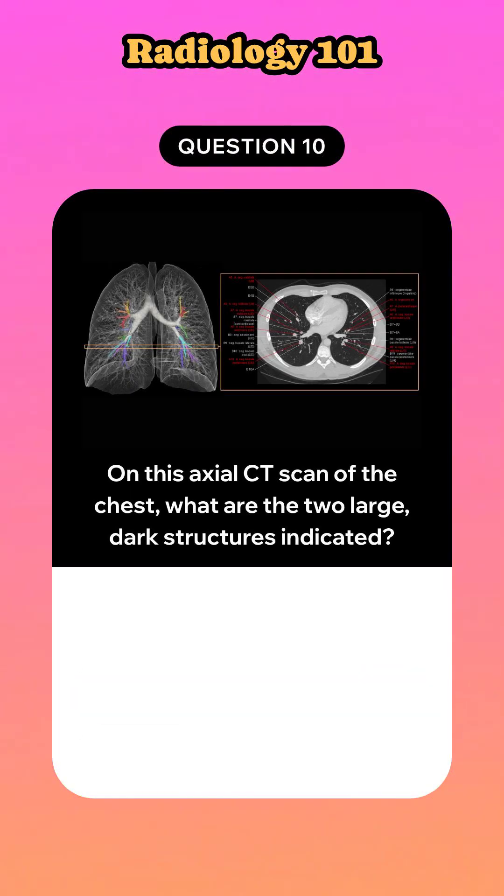On this axial CT scan of the chest, what are the two large dark structures indicated?